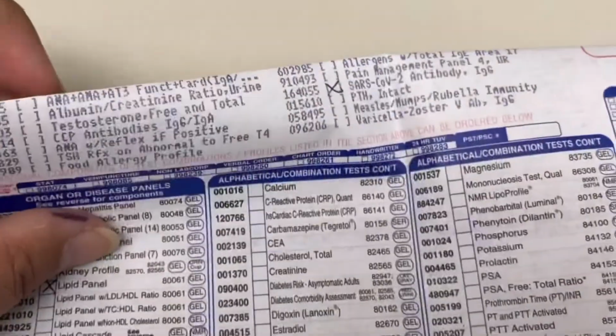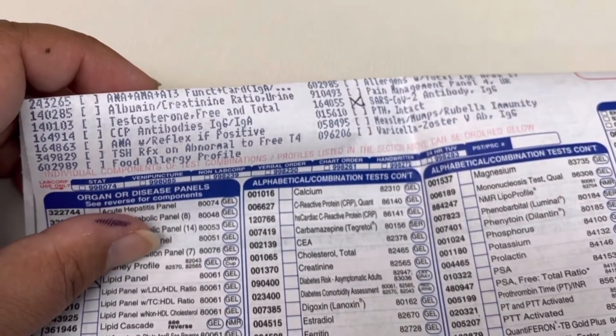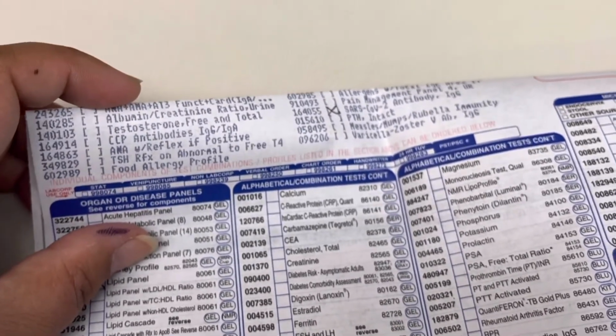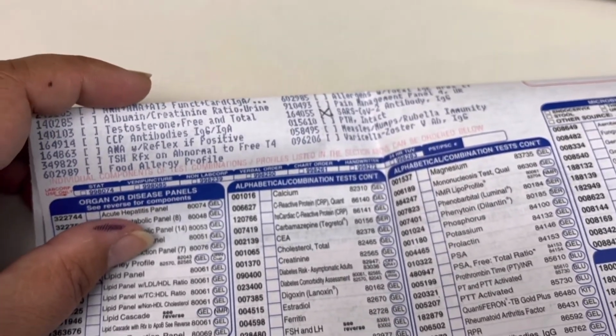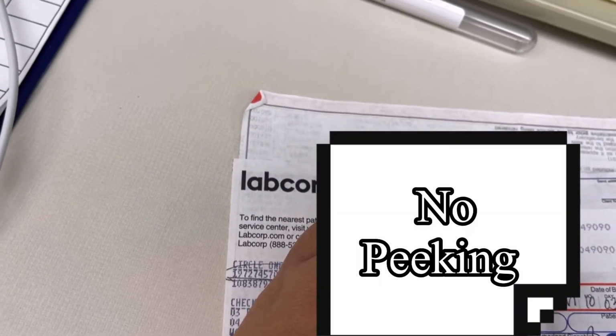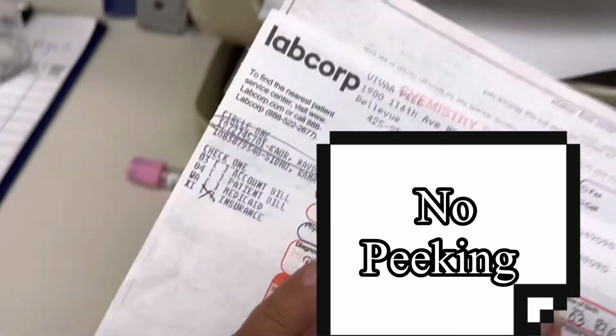Yeah, and also these things right here are extra testing. It won't tell you what kind of tubes it goes into, and that is when you go on the internet and ask Mr. Internet what to do. This is a Labcorp requisition. As you can see, you have to go to labcorp.com and figure out what their specimen requirements are.